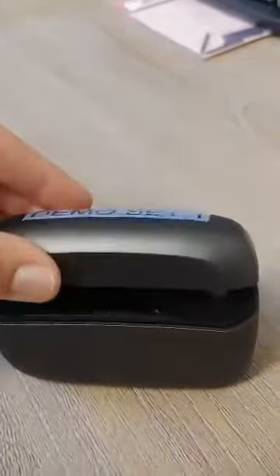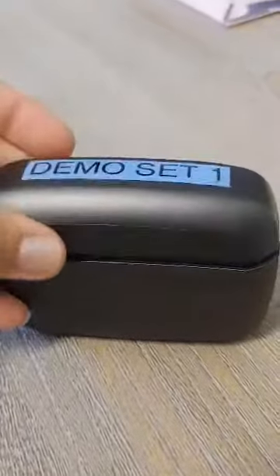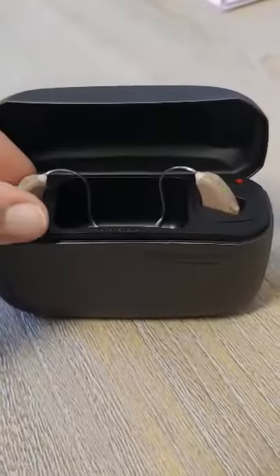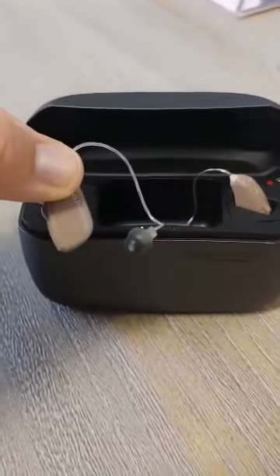You don't have to close this, but most patients do, just to make sure that dust or debris don't get into the devices overnight. Just like that. Just leave them plugged in all night. They're automatically off when they're in the charger. When you pull them out in the morning, they'll automatically turn on as you put them in your ears.